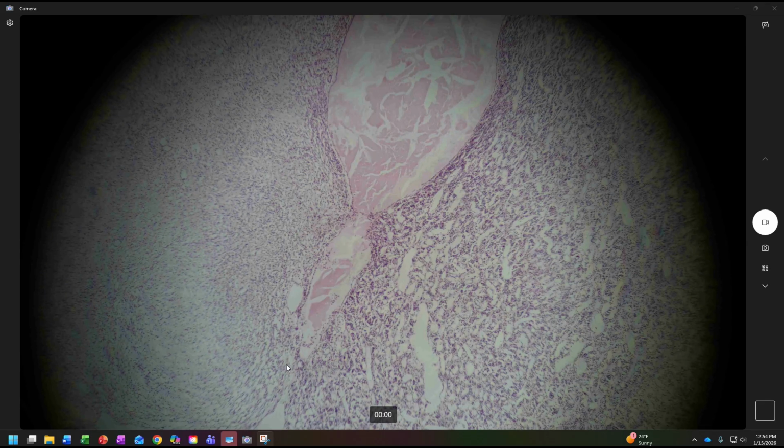And so hopefully, you can see this area over here is visually distinct from this area. Now what I want you to do is take some time. Kind of this space here is the dividing line. We have this area over here and this area over here.